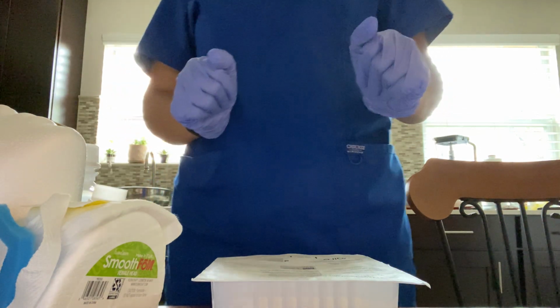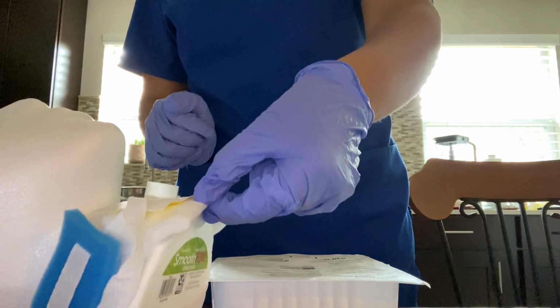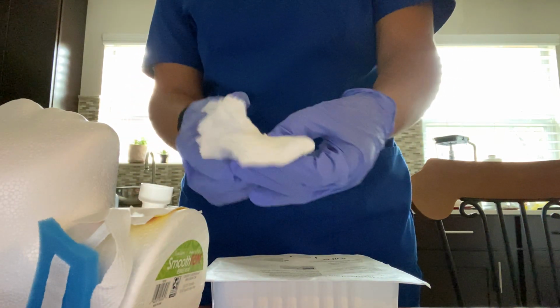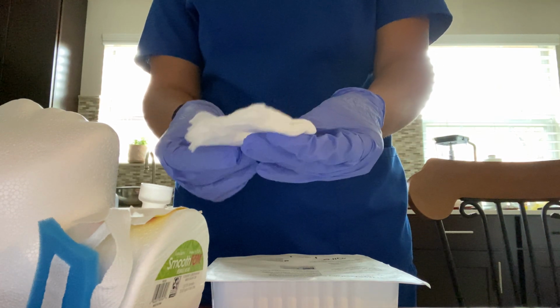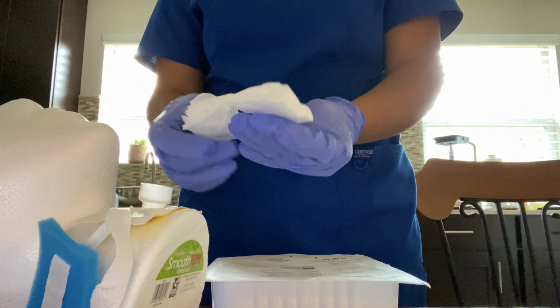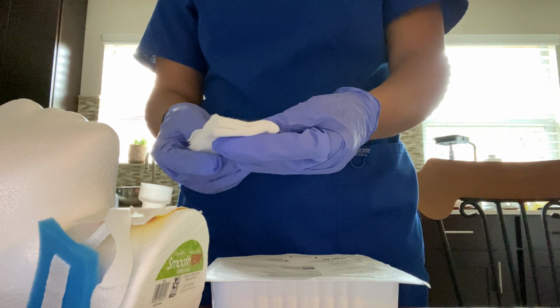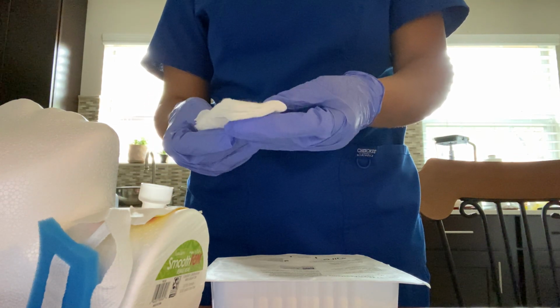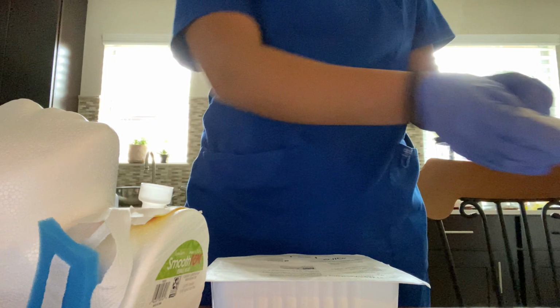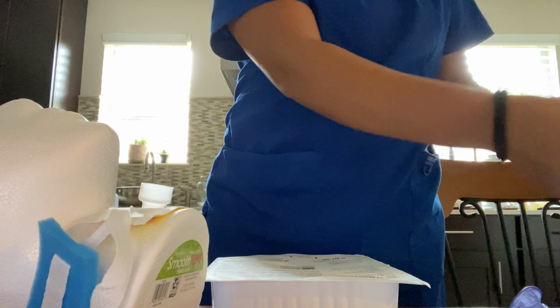Okay. So we're going to remove the trach dressing right here. We're going to check for the color, odor, consistency, and the amount. So, it's not a lot. The color is not abnormal and all of that. So we are now going to note that so we can chart it later when we're done. And then we're going to dispose of that with our gloves.